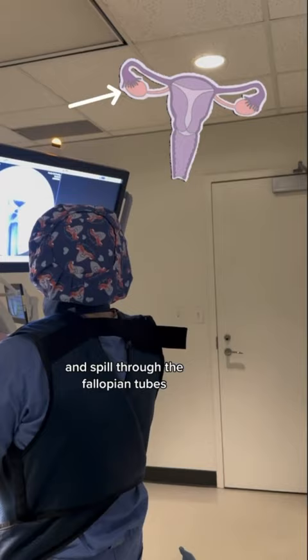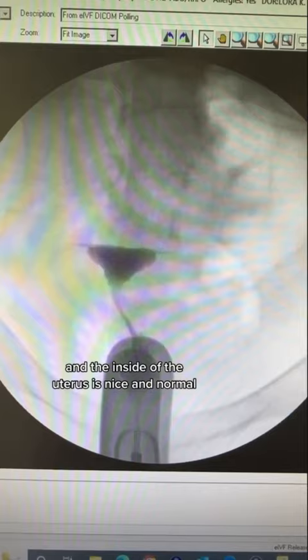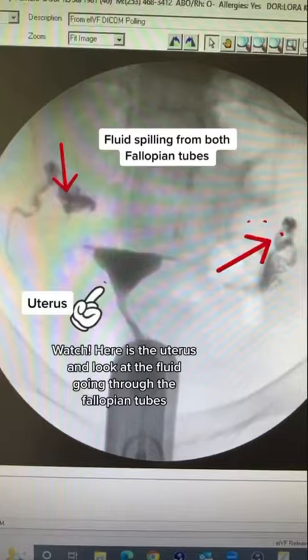This is how we can make sure the fallopian tubes are open and the inside of the uterus is nice and normal. Watch — here is the uterus, and look at the fluid going through the fallopian tubes. It's all happening in real time. Nice, normal HSG.